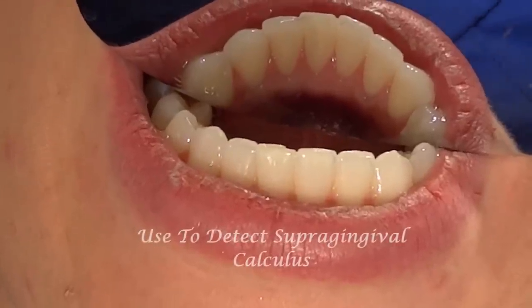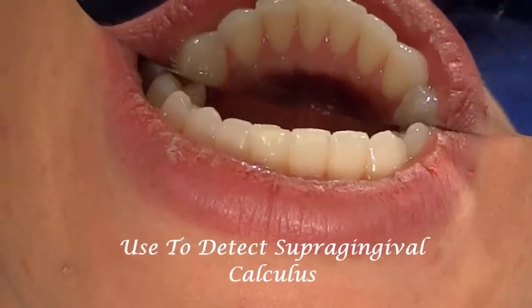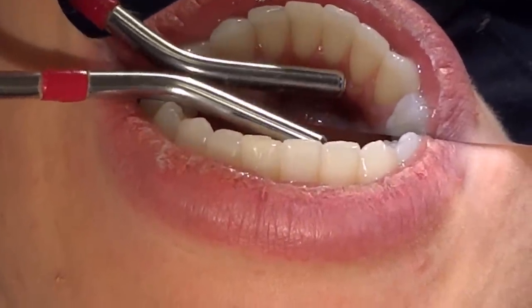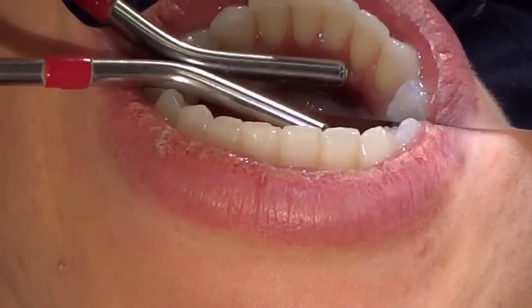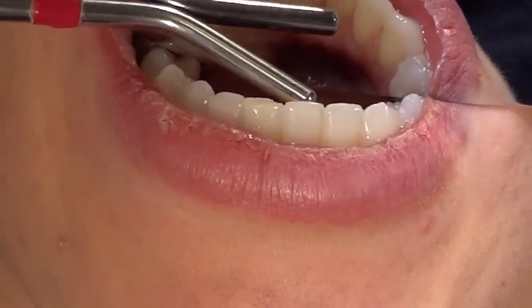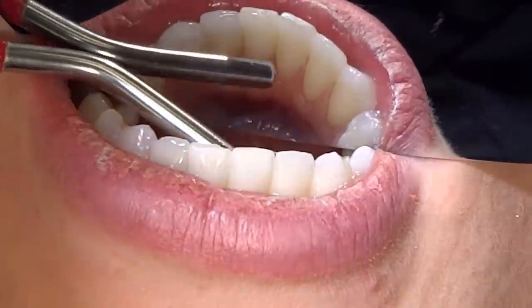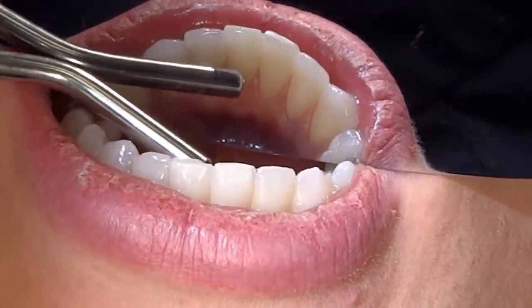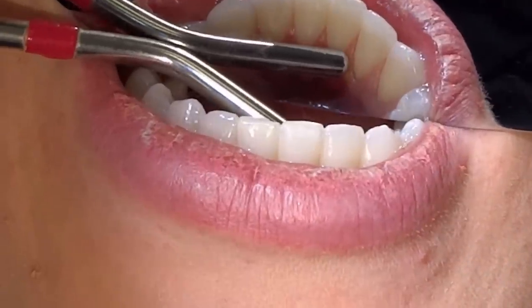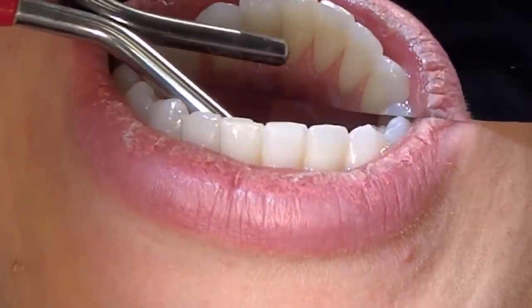Air alone is used in detecting supragingival calculus. When doing this, you want to give a slow and steady stream of air on a particular area. I like to use this most on the linguals of the mandible — nice and slow and steady. You have to use quite a bit of air on a particular surface to be able to see the calculus magically appear.